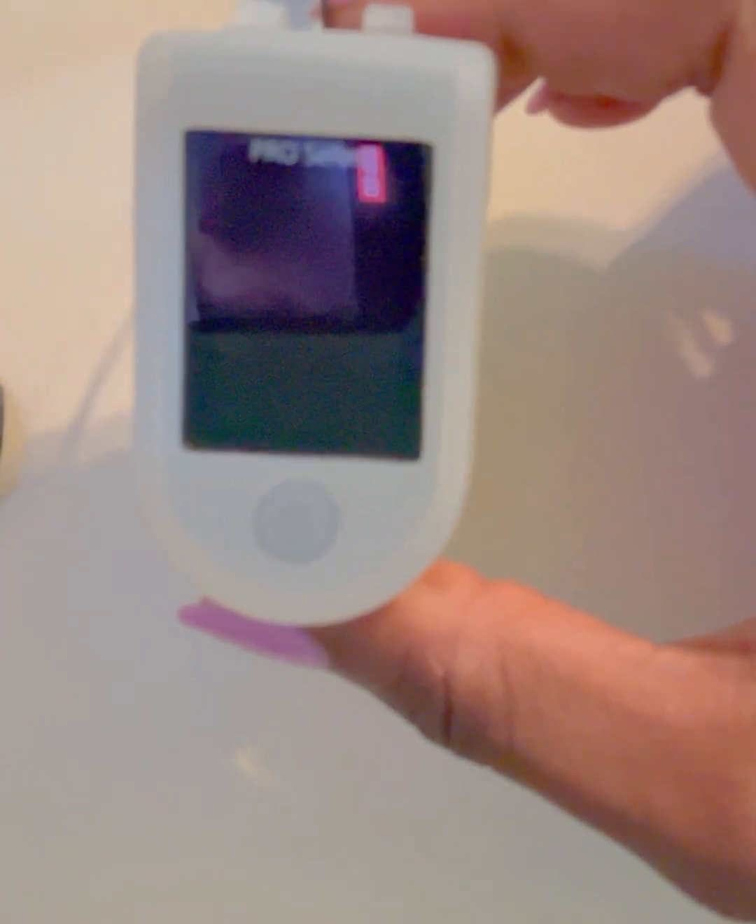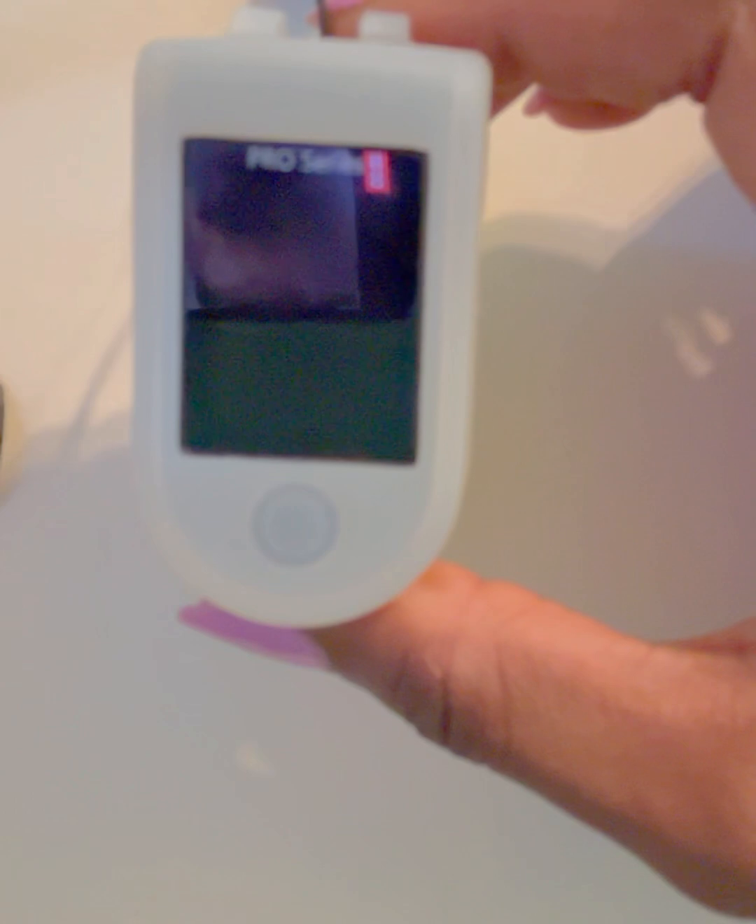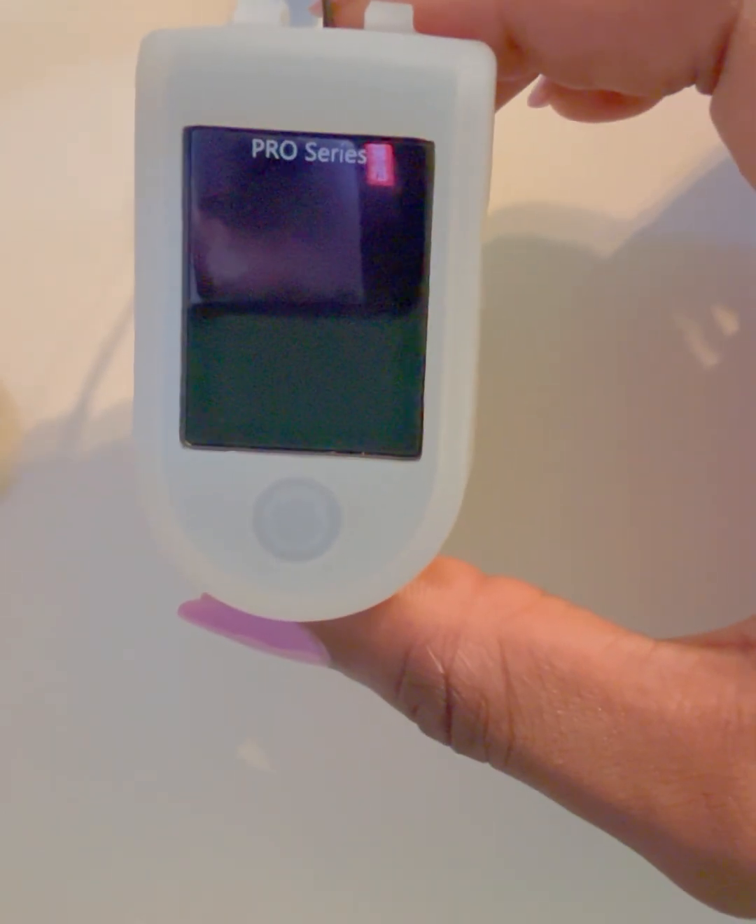A pulse oximeter measures two things: your oxygen saturation levels — the percentage of oxygen in your blood — and your pulse rate, how fast your heart is beating.